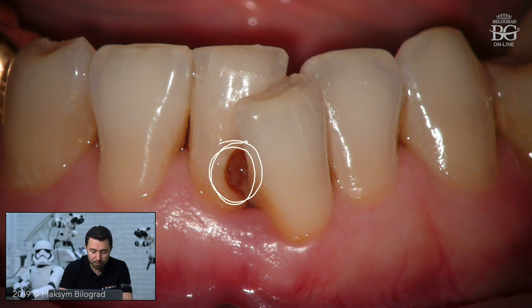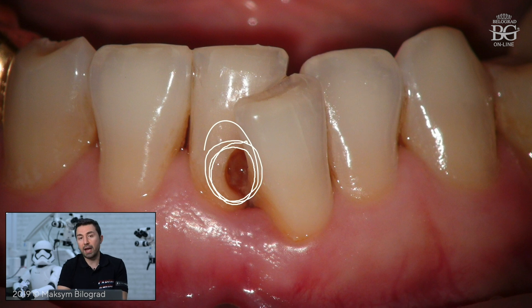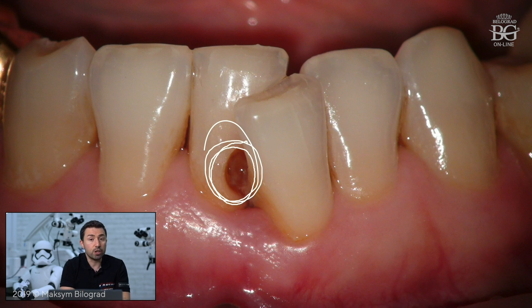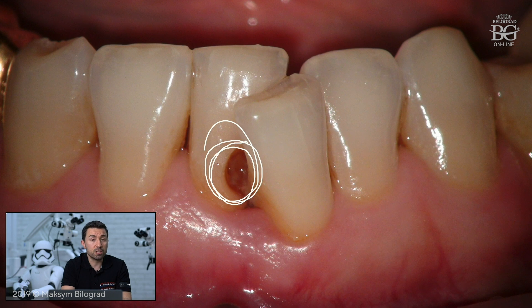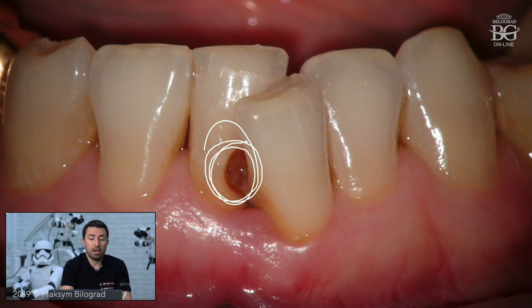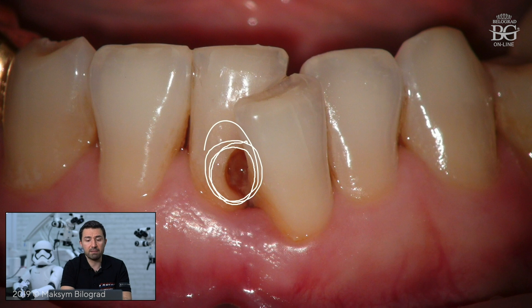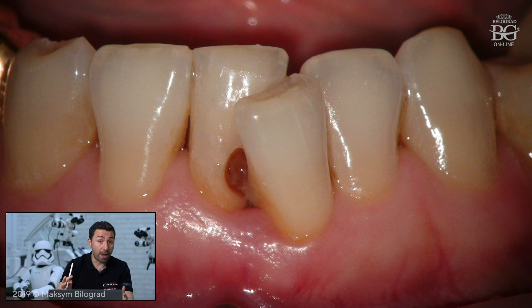The access would be performed through the perforation. With this type of access we can preserve a lot of tooth structure, which is amazing. However, this type of access carries a huge risk of instrument separation or ledge creation during instrumentation. We have to consider that risk and discuss it with the patient. Since the patient was herself a dentist, I told her we could break a file or make a ledge. She said, 'I trust you — I prefer this minimally invasive treatment to save as much tooth structure as possible.'